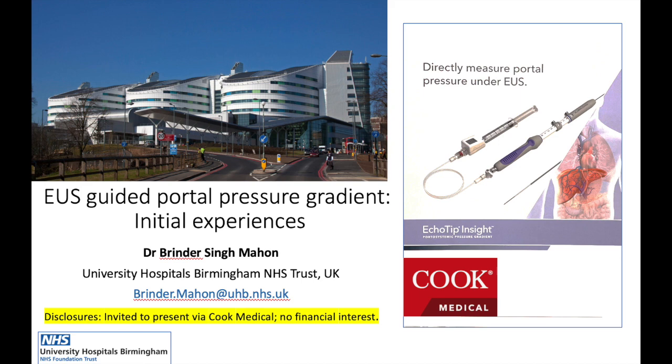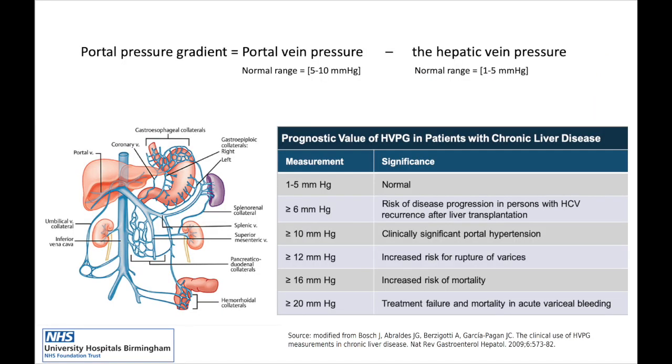Today we'll briefly talk through portal hypertension and its potential measurement, briefly touching upon the current published data, talking through how to assess liver anatomy and find the hepatic and portal vein branches, as well as sharing an EUS PPG case.